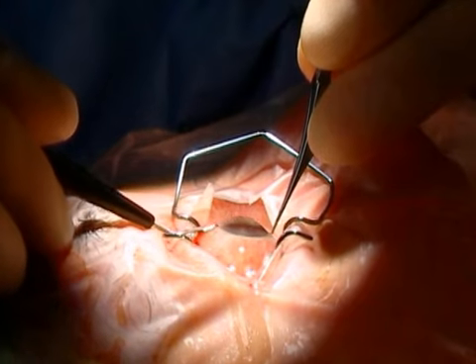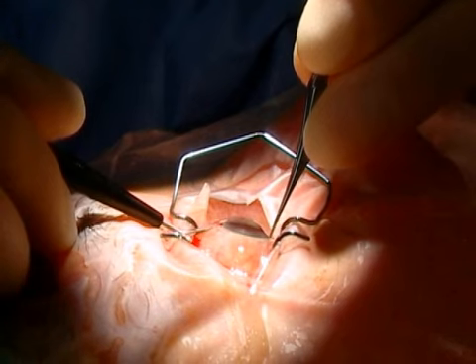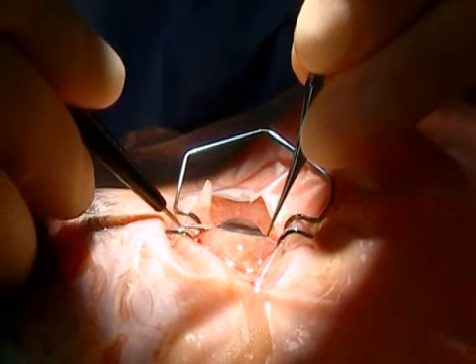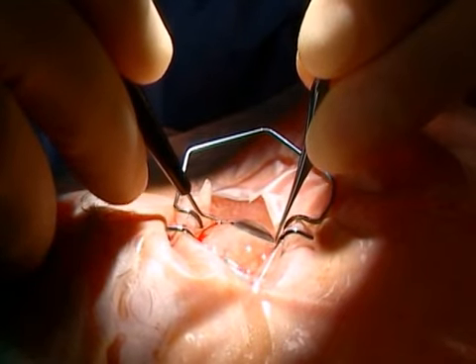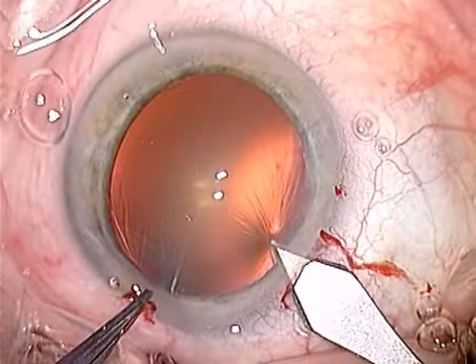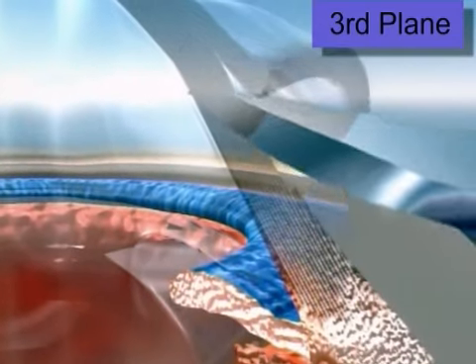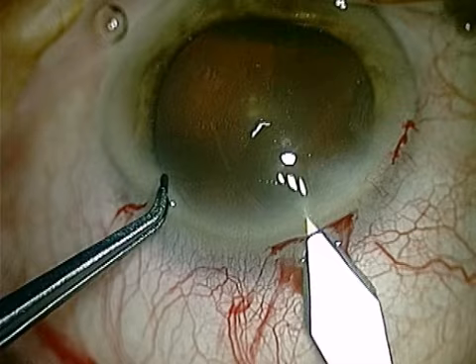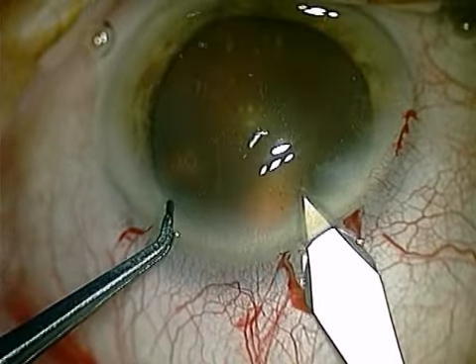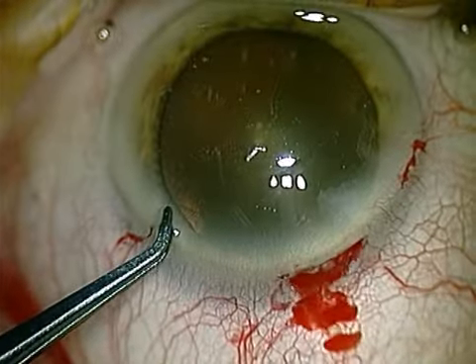The third step simply involves making an angled rather than straight entry into the chamber. You do this by tilting the blade heel up and toe down. As you do so, you'll usually see the characteristic corneal dimple appear from the localized pressure of the tip. What this angled entry achieves is the third incision plane that goes through the floor of the tunnel to connect it to the chamber. It's often performed in any case during an intended two-step incision if you need to enter the chamber more acutely because the tunnel's already long enough.